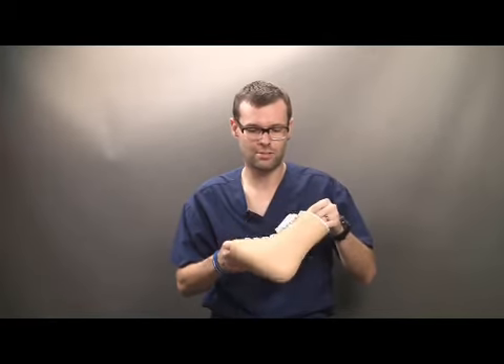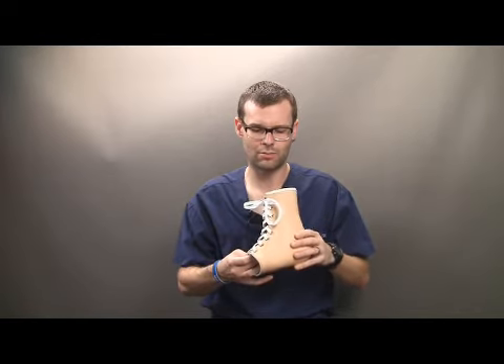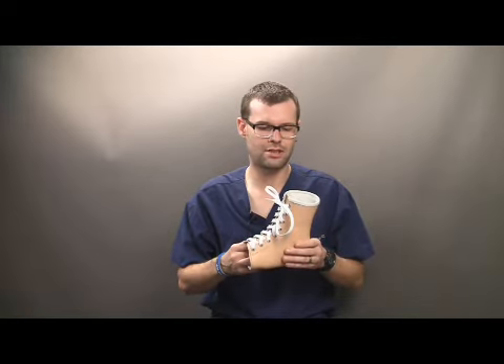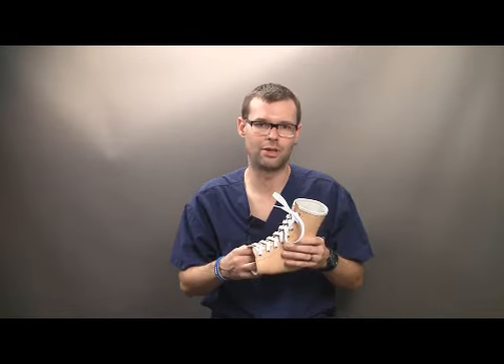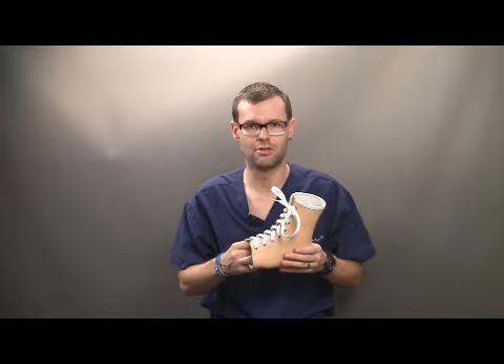Next, the custom pre-tibial shell. Not only is it an unweighting portion of the device, but it allows some motion, reducing the motion of the tibia over the talus and dispersing pressures over a greater area. And fifth, it does break in similarly to a baseball glove, so it does start to mold and conform and allow that limited motion again once the patient has started to use it.